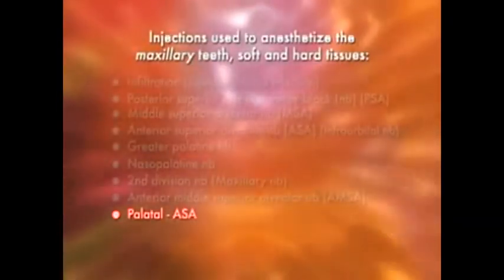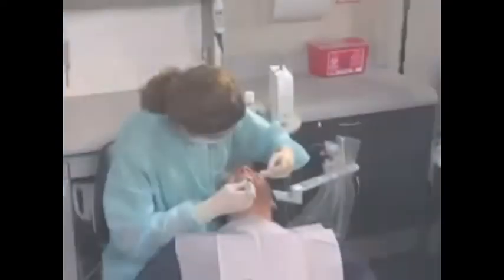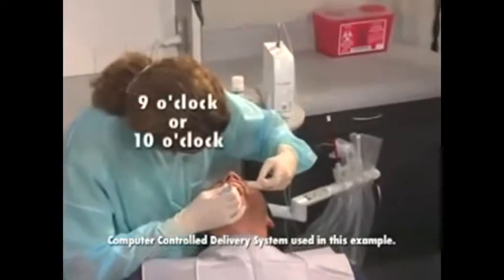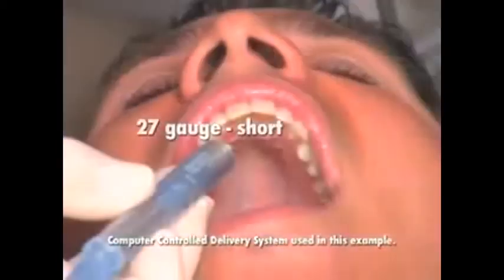The palatal approach to the anterior superior alveolar nerve block, also called the PASA, provides pulpal anesthesia bilaterally to the maxillary incisors and to a lesser degree the maxillary canines, as well as the labial and palatal soft and hard tissues of these teeth. For the PASA nerve block, sit at the 9 or 10 o'clock position, facing in the same direction as the patient. A 27 gauge short needle is recommended.